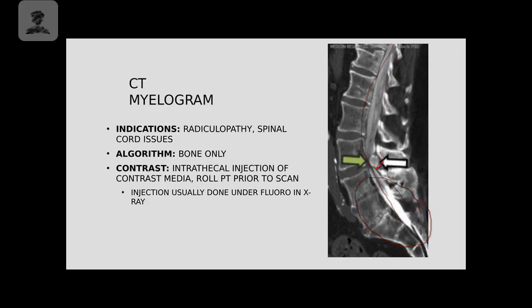And this patient actually has a mass within their spinal canal, and therefore it's pressing on the spinal cord. I would expect this patient to be feeling a lot of radiculopathy, possibly low back pain with that as well, but definitely probably having some issues, probably in their legs. Could affect one side more than the other.